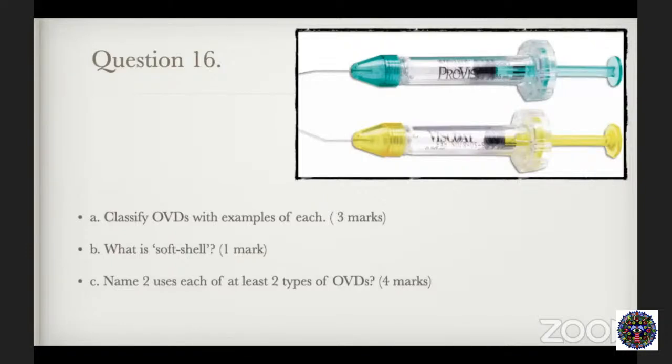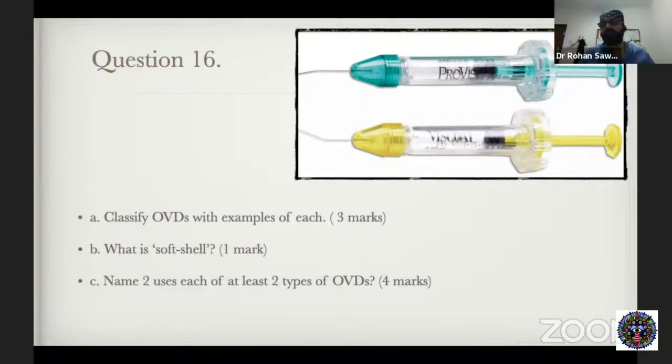Right. If you have a posterior capsular rupture, you can plug with a dispersive, plus push the vitreous back with the dispersive into the posterior chamber and temporarily plug the capsular defect. Sometimes you can also use a cohesive if your rhexis is trying to run away. Inject the cohesive to flatten the anterior capsule so that you salvage a runaway rhexis. And if your pupil is not dilating well, just inject the cohesive so it will try to mechanically induce mydriasis.